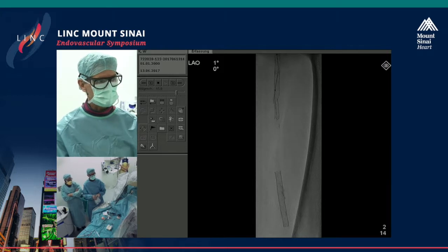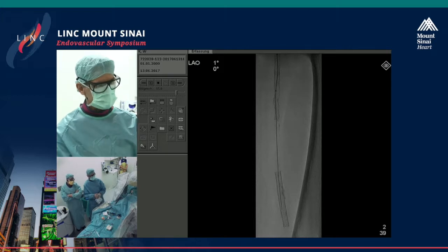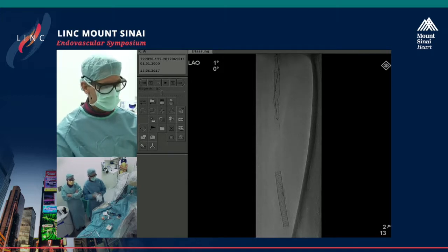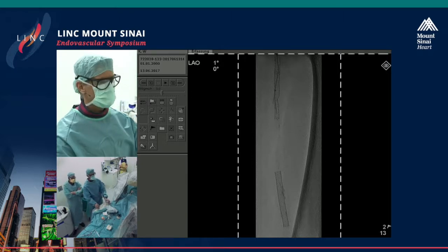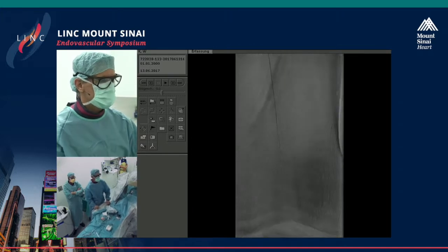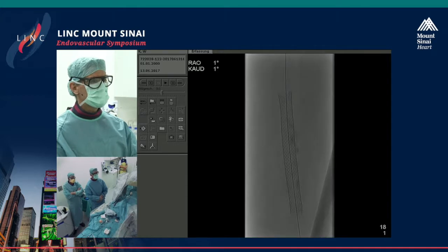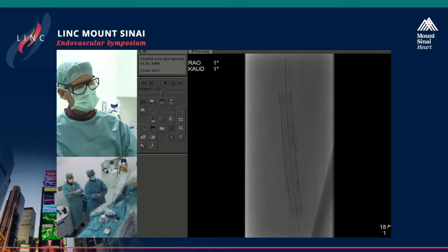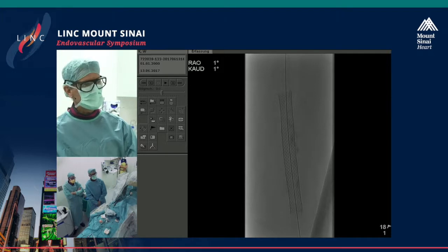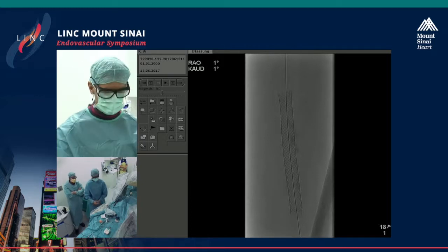The distal stent was open, and our first impression was that it is a Supera stent — however it's not. That's actually an old wall stent. You can see at the ends: Supera has smooth ends, but here are these pokey ends and the structure is different. This stent was implanted in 2002 and is currently open — that's quite impressive. It's a short stent.